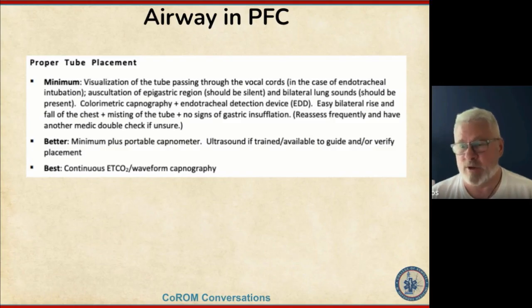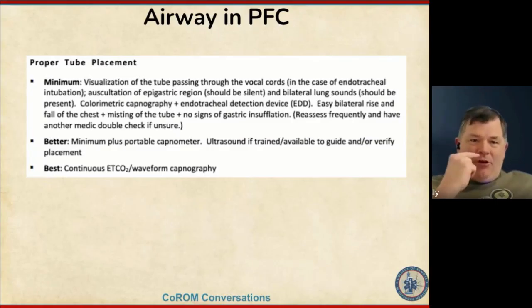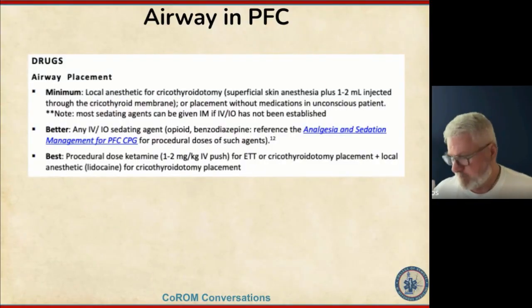I think the capnometer is phenomenal. It makes it idiot proof. I mean, we design better idiots all the time, but I think that makes it really hard to think you're in the wrong spot. And it's right there on the NPA anyway. So you've done that as you go through your airway ladder. You have the NPA and the ETCO2 is right there. Then you intubate. It's right there, and why not? It's golden rule. That works really well. But honestly, this is where the basics count. You don't need much more than the basics. If you have a stethoscope, listen to the stomach, listen to the left lung, listen to the right lung, and I think you'll be fine.